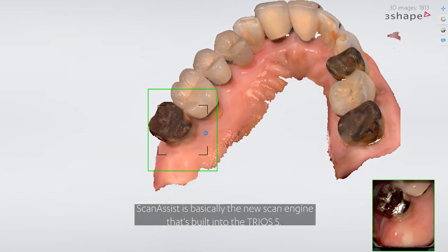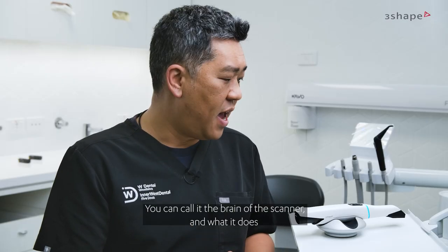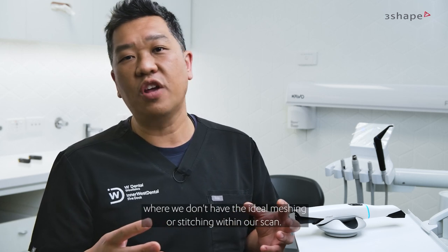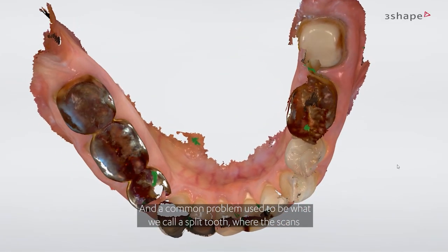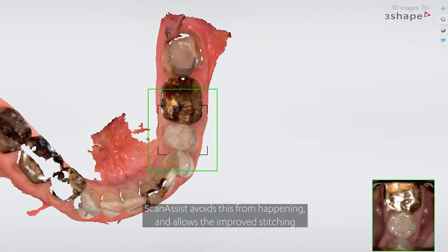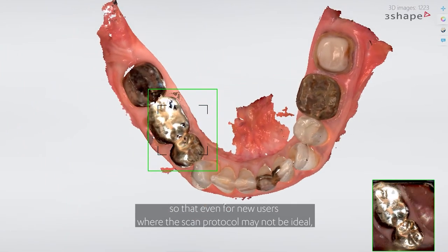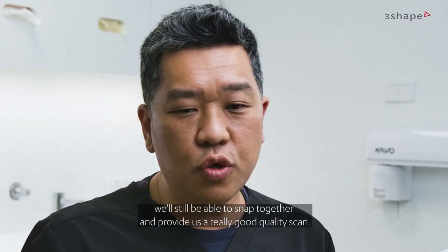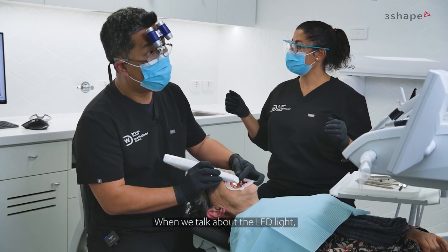One of the new features of Trios 5 is what we call Scan Assist. Scan Assist is basically the new scan engine built into the Trios 5 — you can call it the brains of the scanner. It allows us to prevent areas where we don't have ideal meshing or stitching within our scan. A common problem used to be what we call 'split tooth,' where scans don't marry up and we get stuck halfway through scanning. With Scan Assist, this is avoided, and even for new users where the scan protocol may not be ideal, we're still able to snap together and provide a really good quality scan.